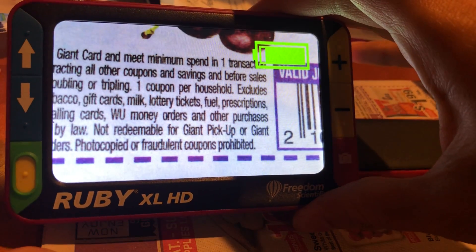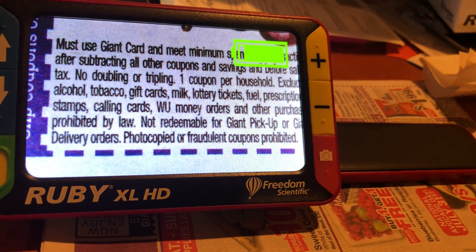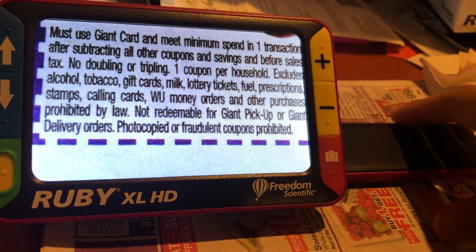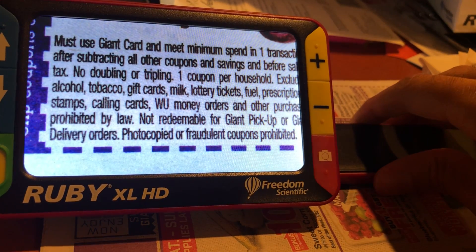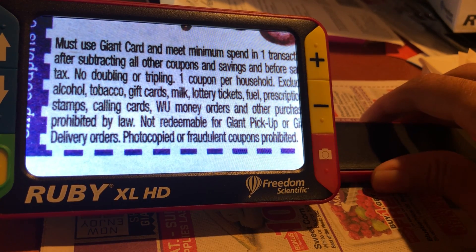Once you deploy the stand, the device automatically powers on. The stand is perfect for reading documents that are on a table — in this case, we have a newspaper on a coupon page.